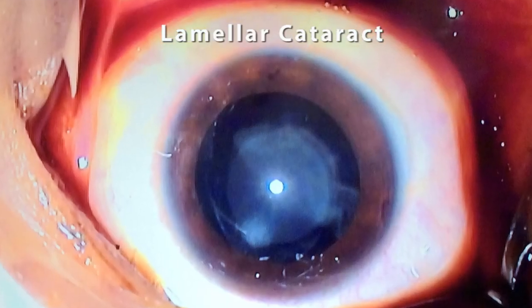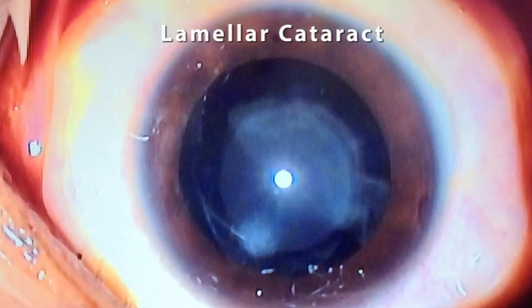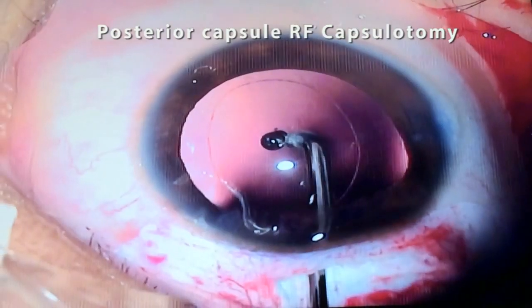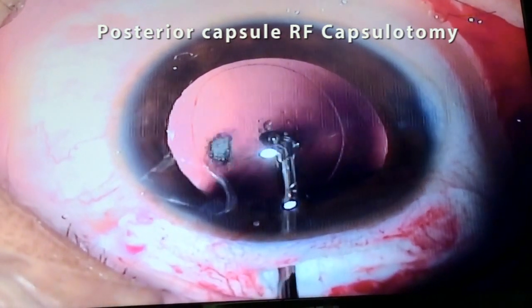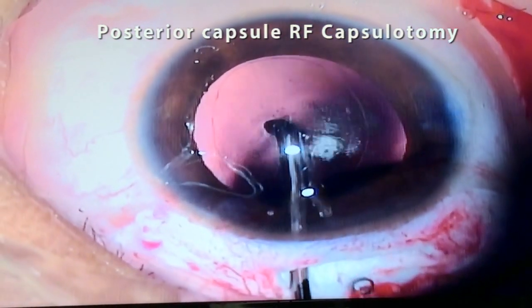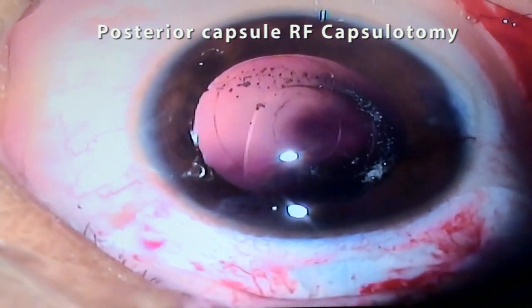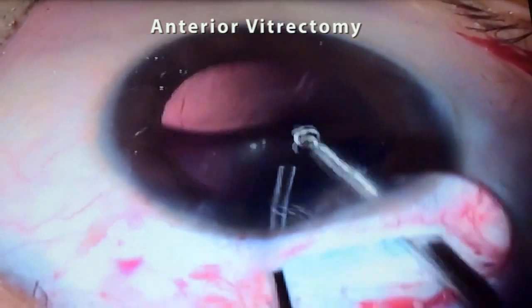Pediatric cataract poses a challenge to surgeons in making a perfectly round-edged capsulotomy. With the help of RF diathermy, anterior and posterior capsulotomy can be easily done with minimal to no complications. Vitreous, which prolapses into the anterior segment after posterior capsulotomy, can be removed with a vitrectomy cutter.